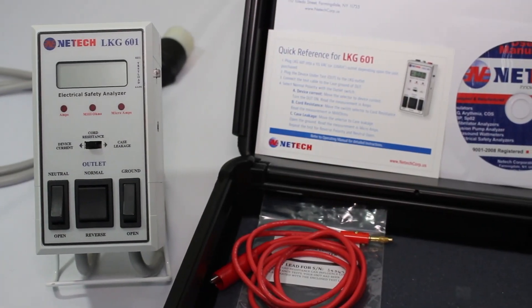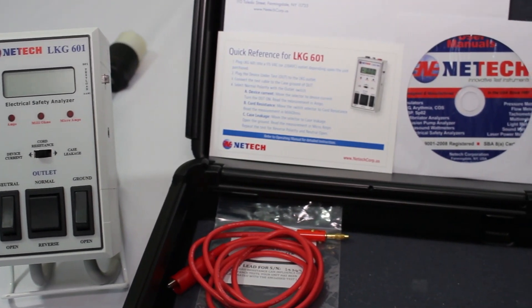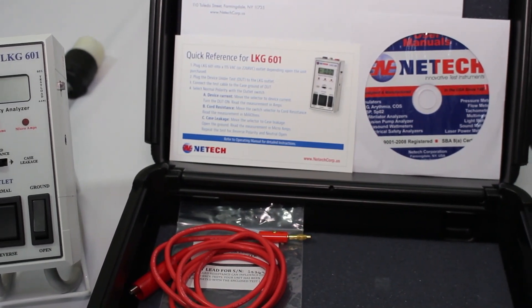Performing to various international standards such as AAMI and IEC601-1, the LKG601 is a necessary tool for all biomedical test professionals.